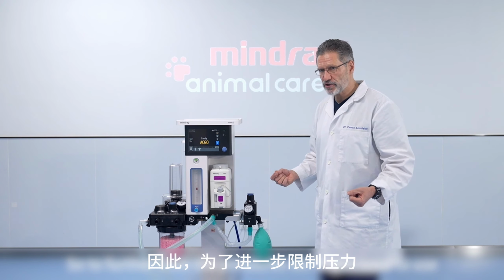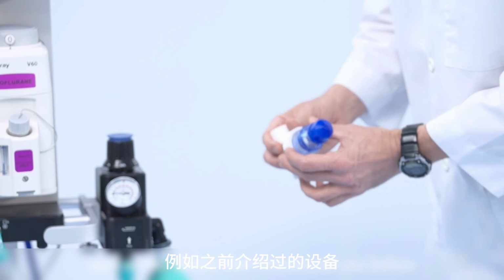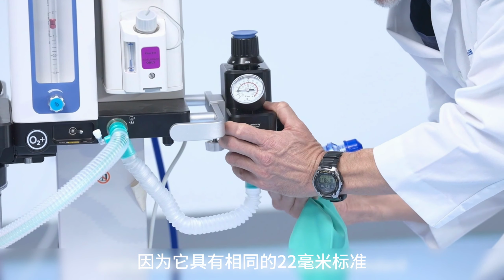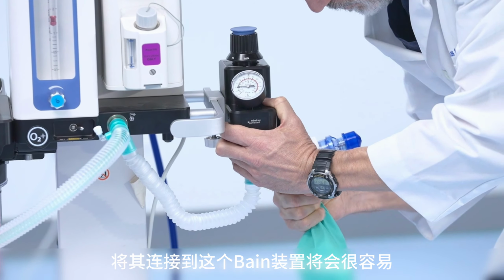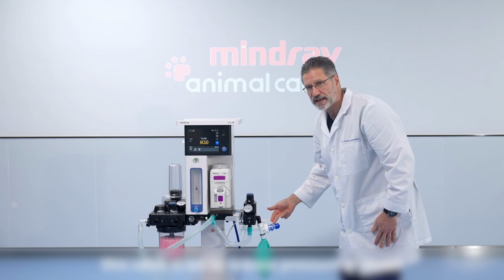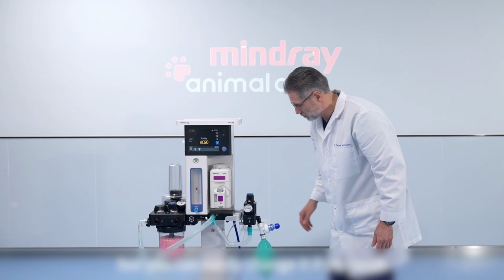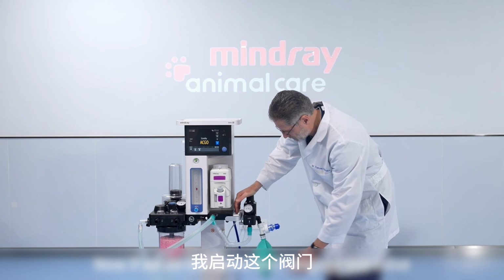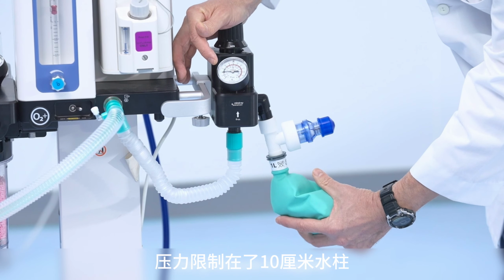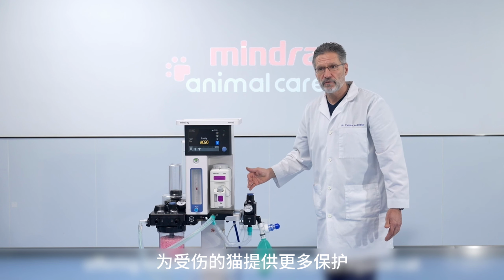So to further limit the pressures, we might need to use an extra pressure relief mechanism such as this device that I introduced you before. And because it has the same 22 mm standard, it will be easy to attach it to this Bain block. And now this valve is set to release pressure at about 10 centimeters of water, but you can easily change it if you wish. Now if we do the same test, I engage this valve, I squeeze the bag, and the pressure is capped at 10 centimeters of water, offering much more protection for an injured cat.